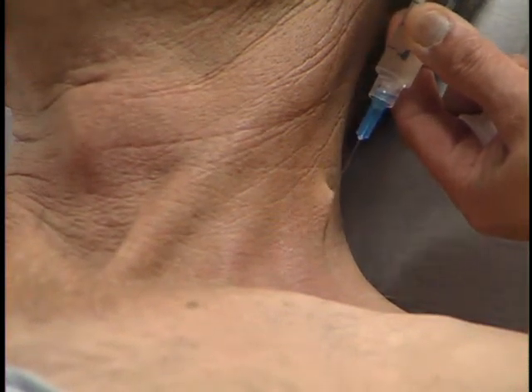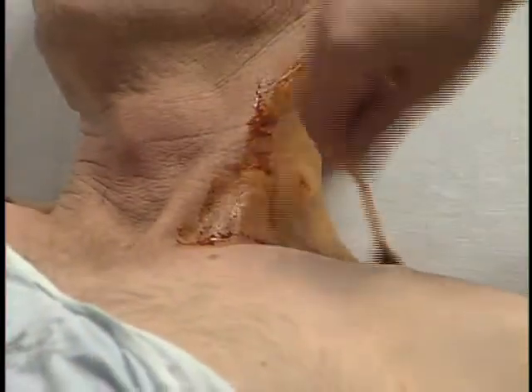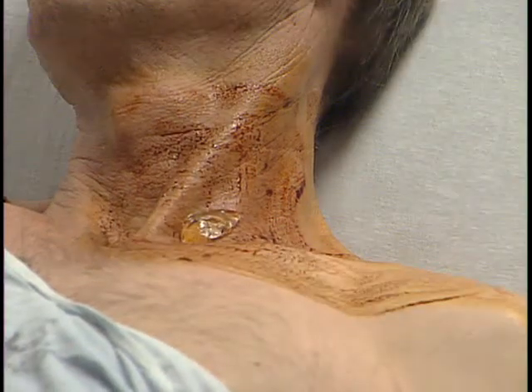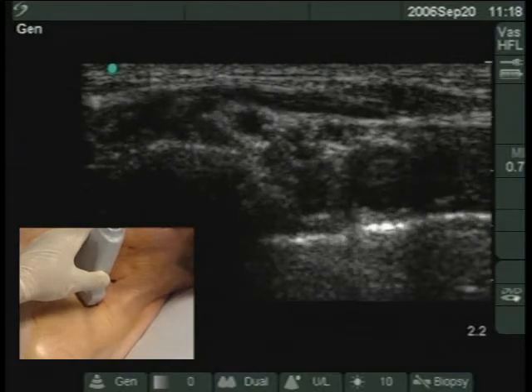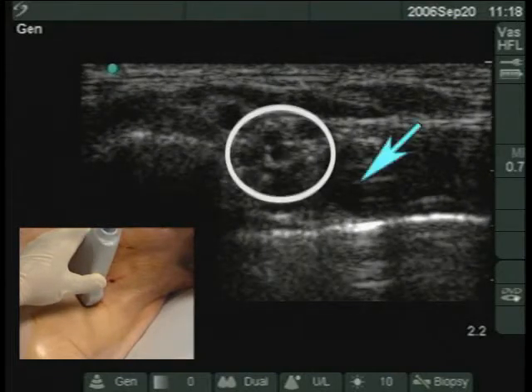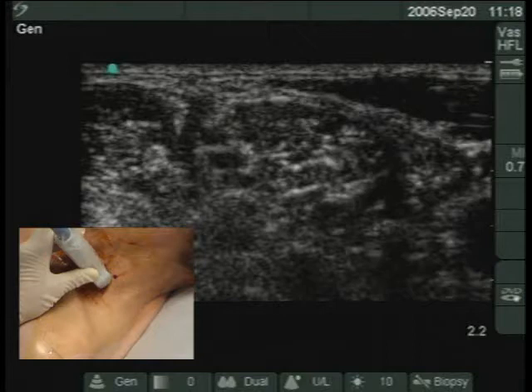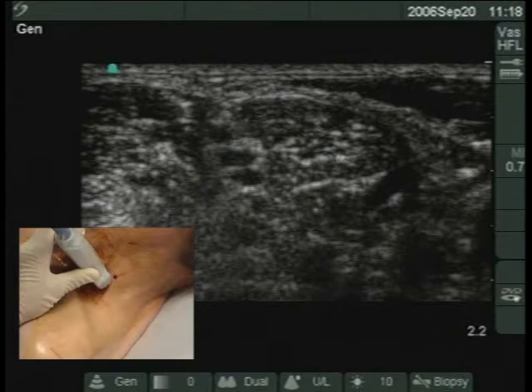The patient is prepared for the procedure using standard sterile technique. For educational purposes, sterile draping has been eliminated to provide the viewer with orientation to the patient's head and shoulders. Ultrasound gel is placed at the supraclavicular area on the neck. After the transducer has been sheathed, it is placed across the neck in a transverse orientation at the supraclavicular level. Locate the trunks of the brachial plexus lateral to the subclavian artery. On further cephalad movement, the neural structures change to a string of beads between the scalenus anticus and scalenus medius. Move the transducer laterally or medially so the neural structures are positioned in the center of the screen.